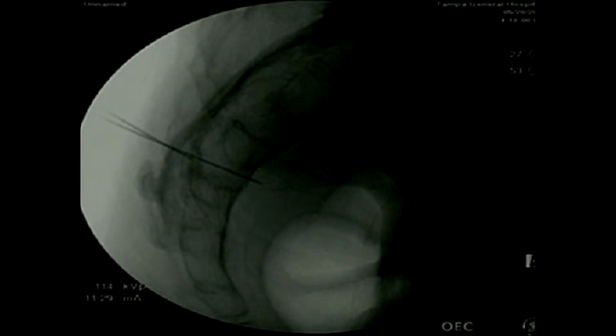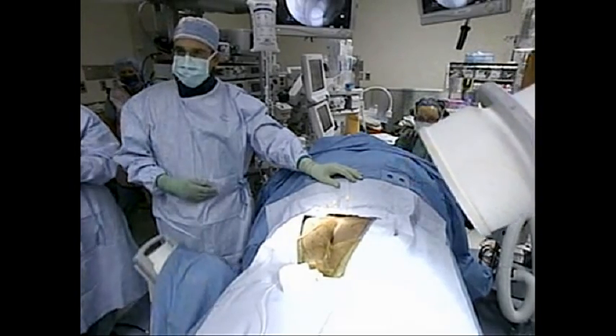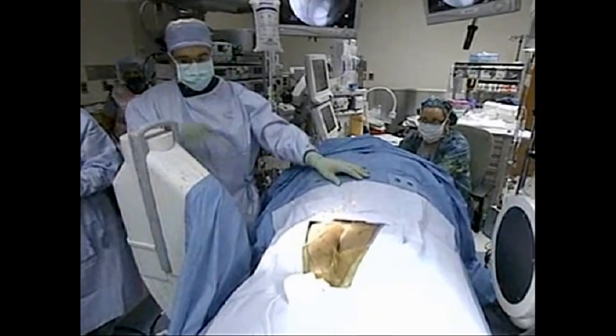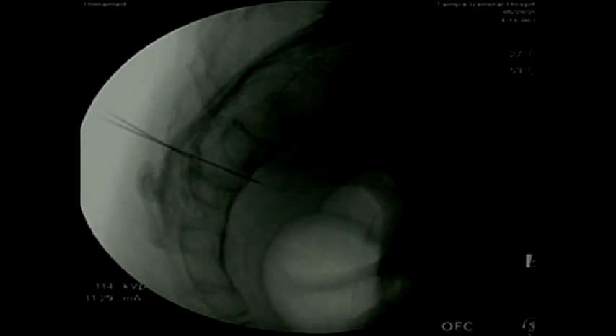He's using fluoroscopy here, trying to find the exact spot. Sometimes it can be difficult — depending on whether the patient has had any type of scar tissue over time — to get into the actual foramen. He is happy with how medial or lateral that position is, and is going back to the lateral view.